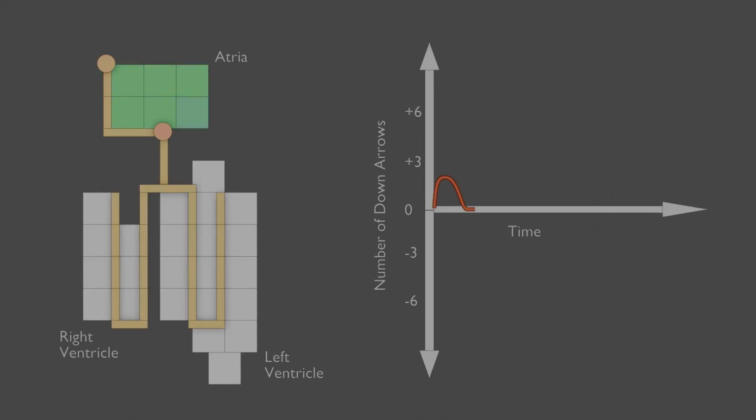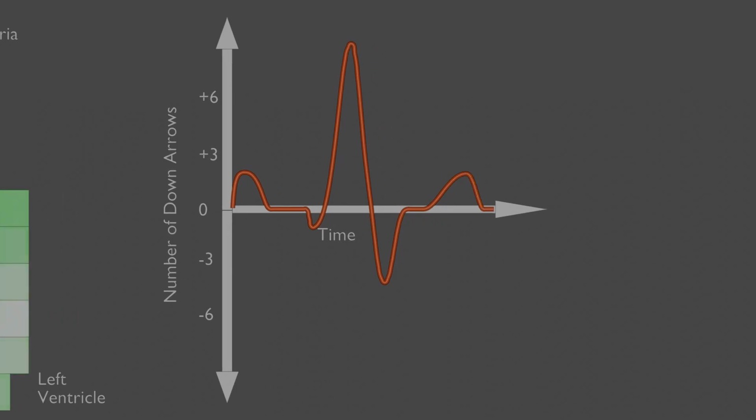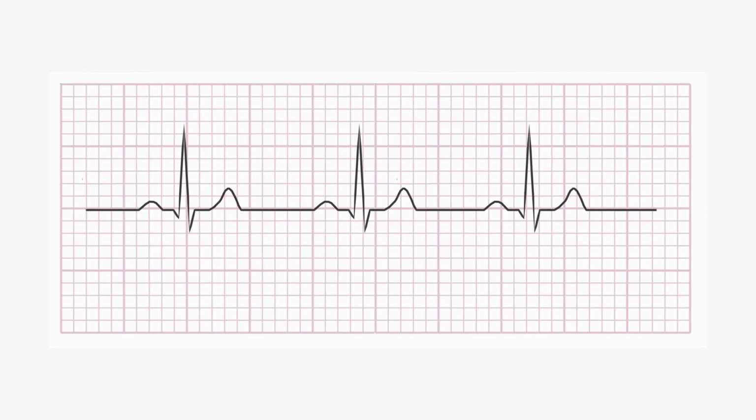Up until this point, I've been showing you EKGs graphed on a traditional coordinate axis system. That's this guy. X and Y axes, each with their own definition and scale. In the context of an EKG, we always understand that the horizontal axis will be time and the vertical axis will be voltage. And since we've got that assumption, and for economy, we can just work on graph paper.